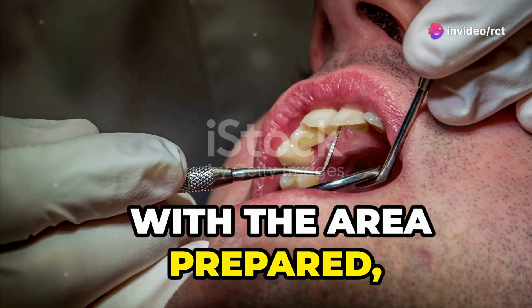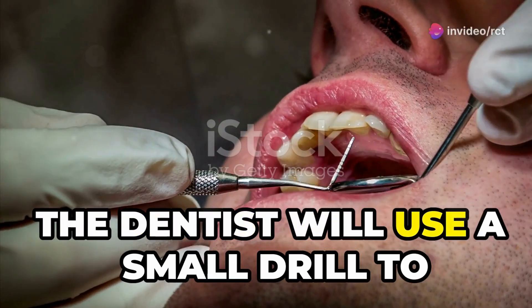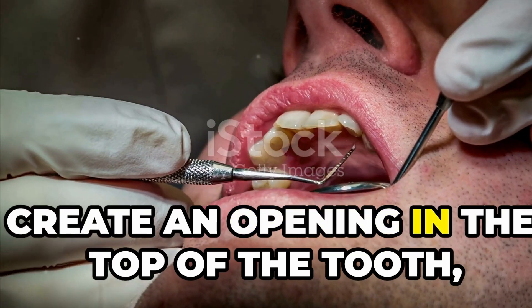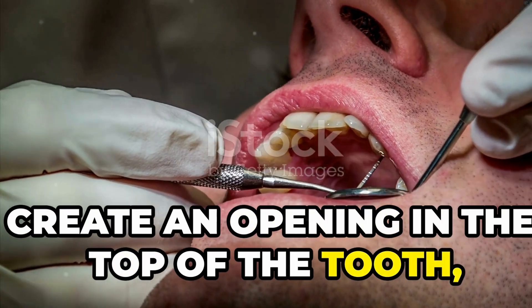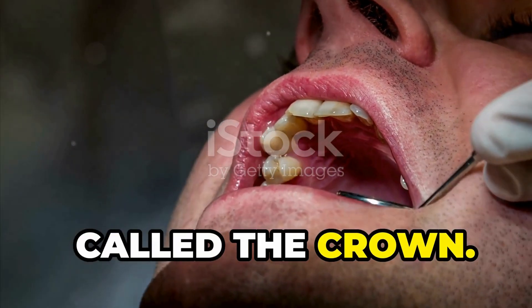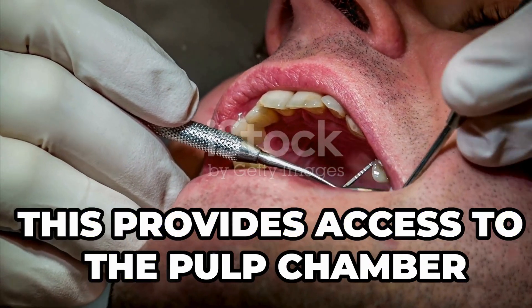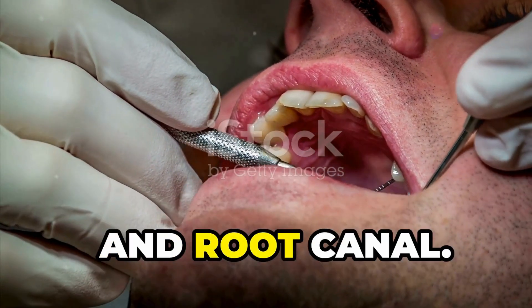With the area prepared, the dentist will use a small drill to create an opening in the top of the tooth, called the crown. This provides access to the pulp chamber and root canal.